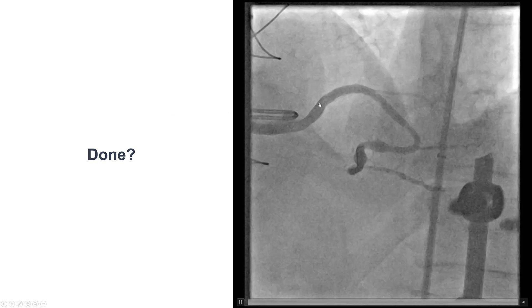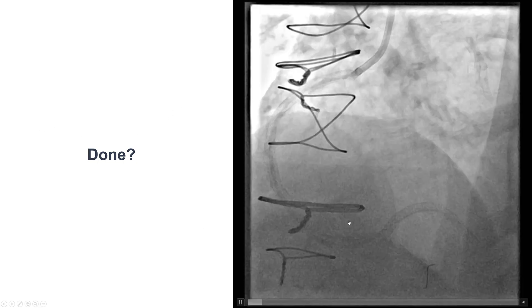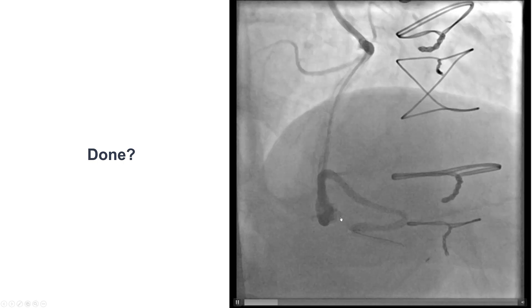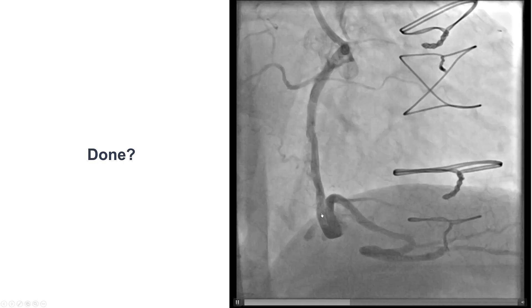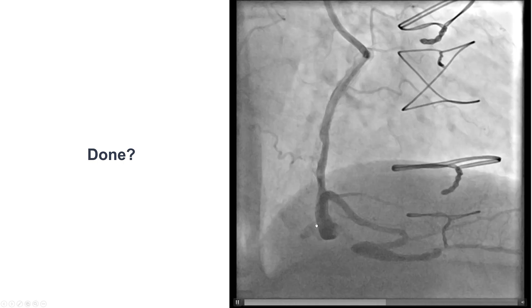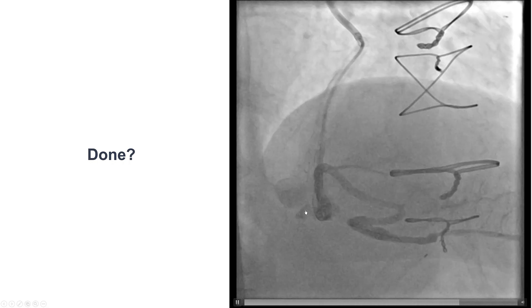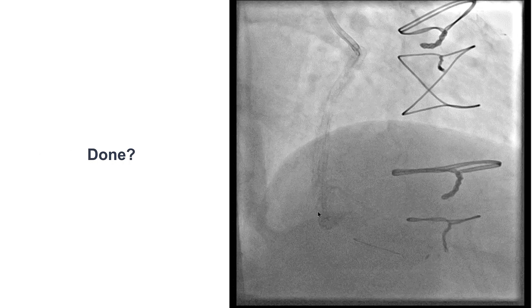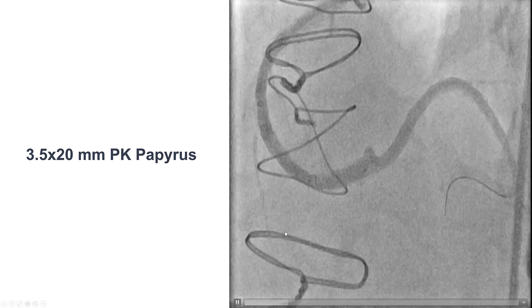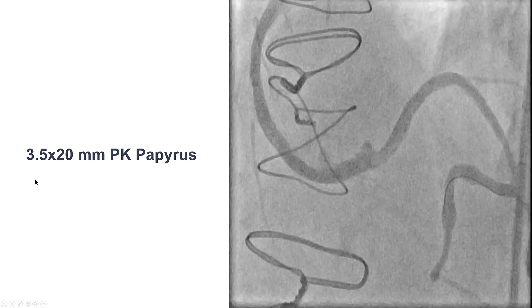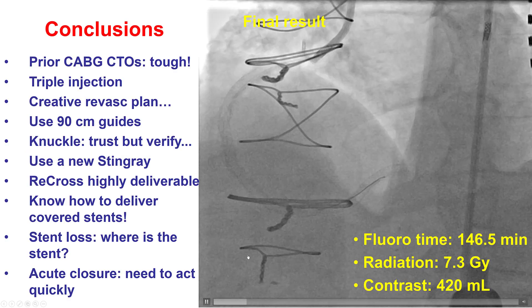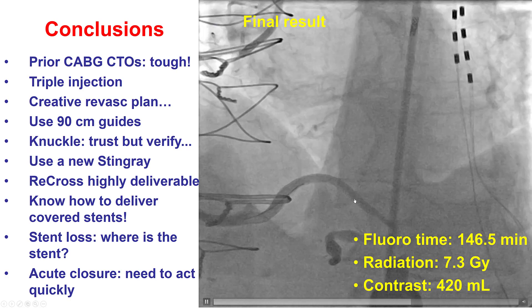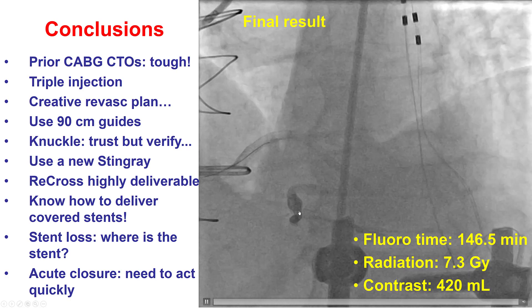That resulted in resolution of the hypotension as well as the ST segment changes. However, there was still some staining in the distal right coronary artery. On repeat angiography, although improved, there was still some oozing and extravasation outside the artery. We decided to place another covered stent — another PK Papyrus. This was the final result with TIMI flow into the vessel.